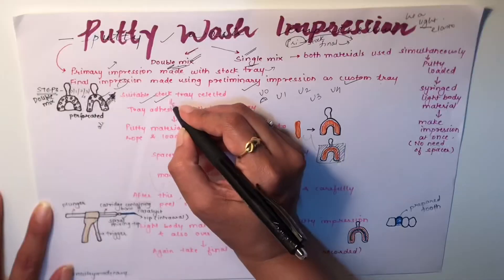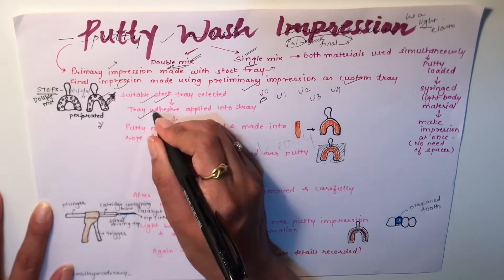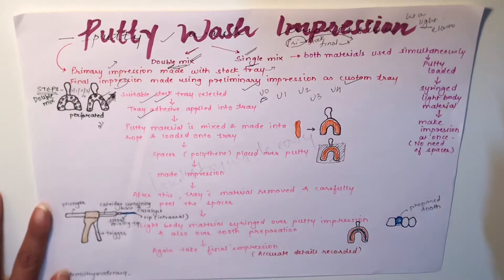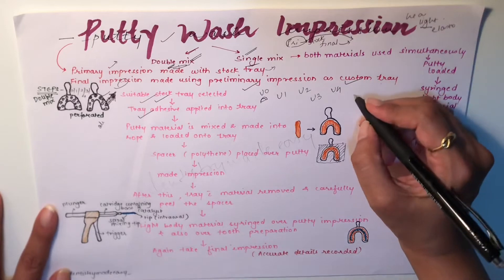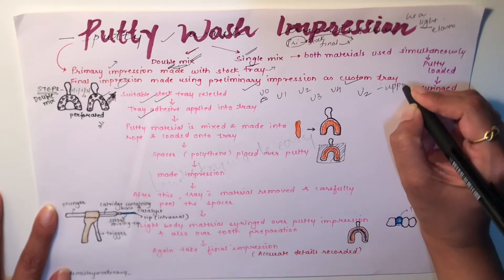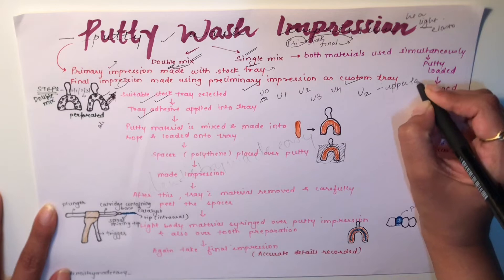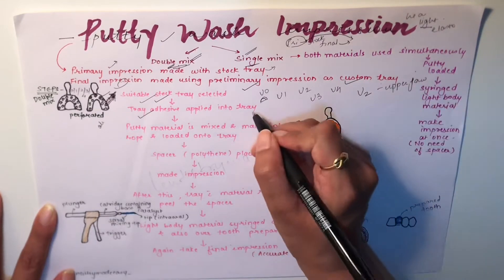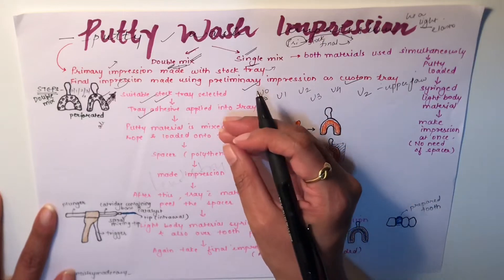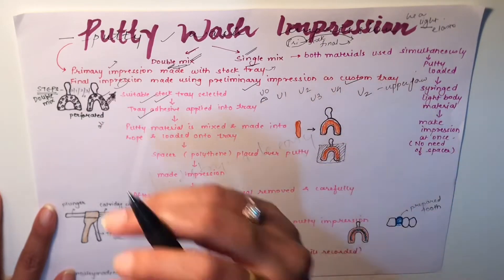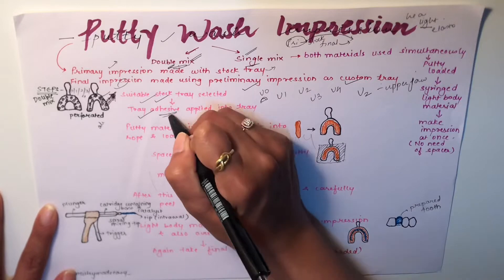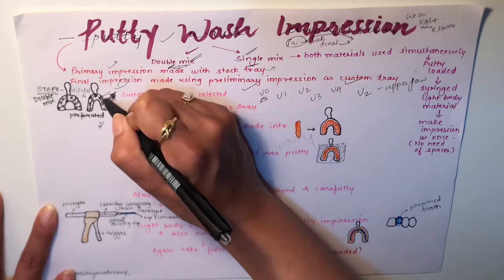The next step is to apply tray adhesive over the selected tray — for example, tray U2 for the upper jaw. The adhesive ensures that your impression material sticks well and adheres properly to the tray.